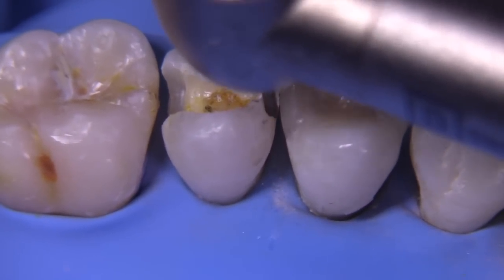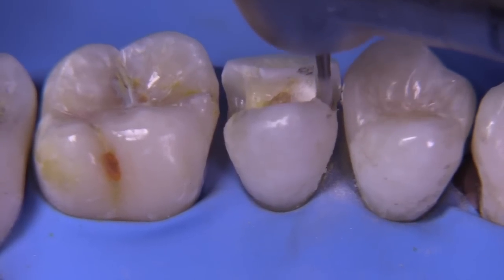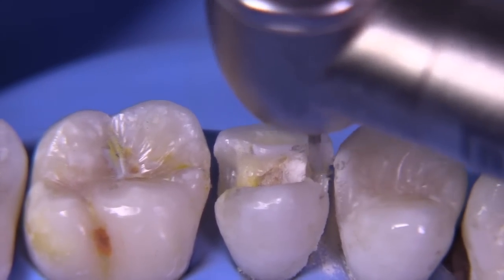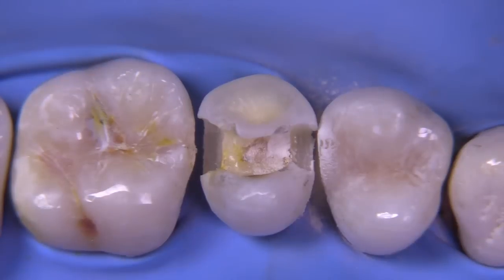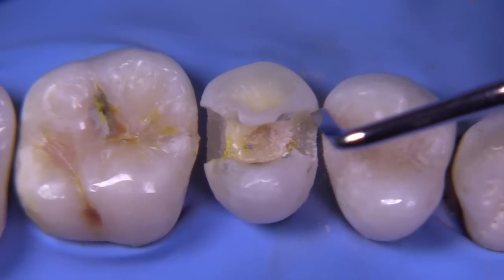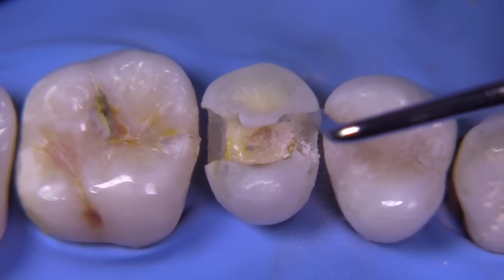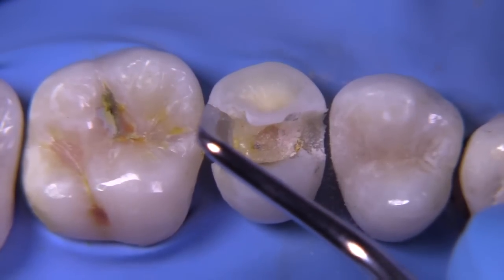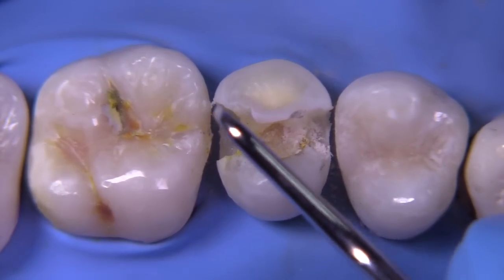We'll go ahead and do that on the mesial as well. I like to seek the gingival clearance first and then move towards the facial and lingual. In this particular case, the lingual contact was broken very easily, then the gingival, and then we're working on the facial. To break contact, it's a good idea to undermine the enamel with the 245 and then utilize hand instruments to chip away the enamel. Even though we're doing a composite and we don't want our internal line angles to be sharp, we can still use the chisel — or hatchet in this case — to chip away that loose enamel. Always have the long end of the cutting blade towards the wall that you're removing; the bevel should be facing away from the wall you're trying to extend and remove the enamel from.